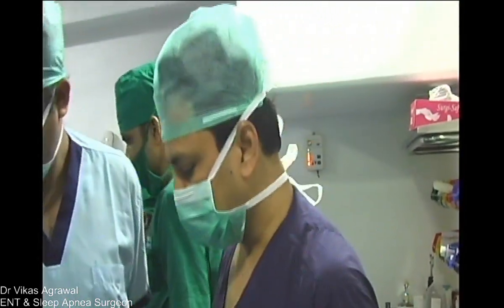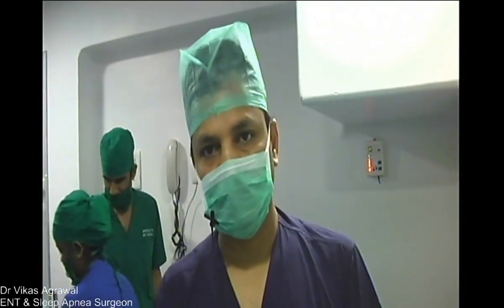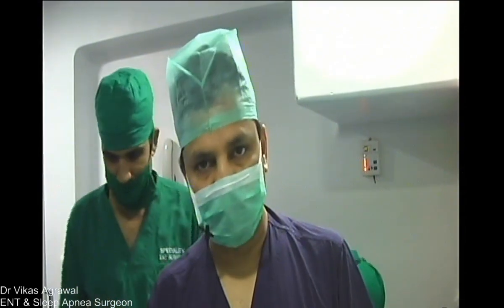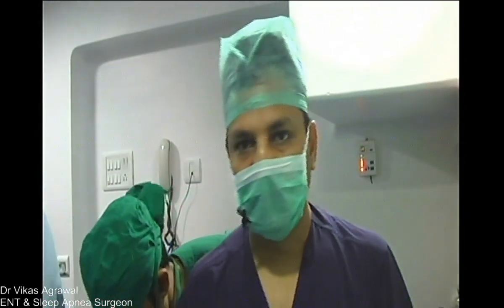We cannot assess where is the obstruction happening, and for that reason we have to take the patient under sleep, and that's called drug-induced sleep endoscopy, because you have to induce the sleep with some drugs. In this case, dexmedetomidine and midazolam are the commonest drugs which are being used.